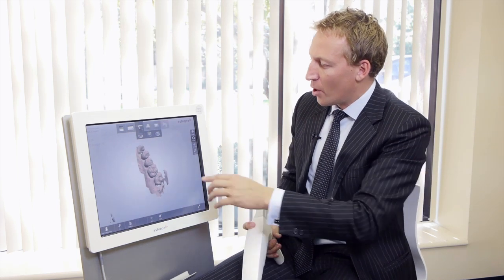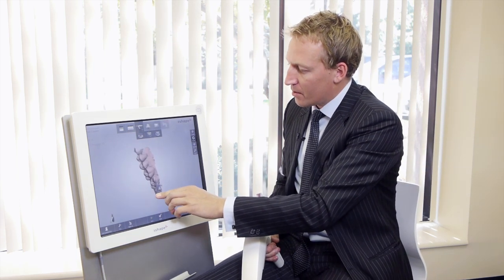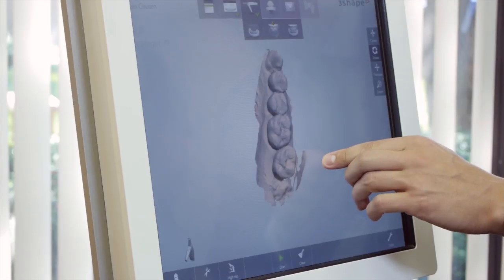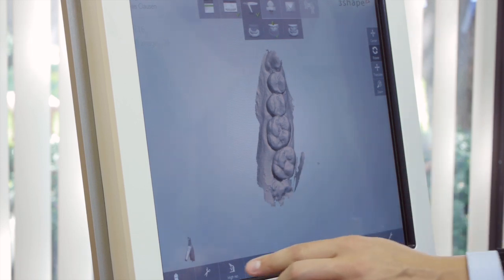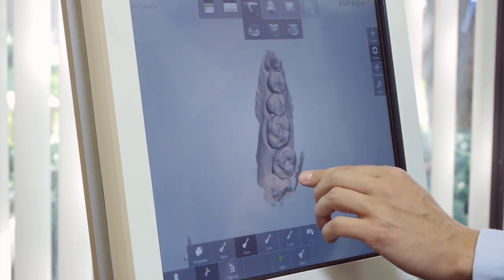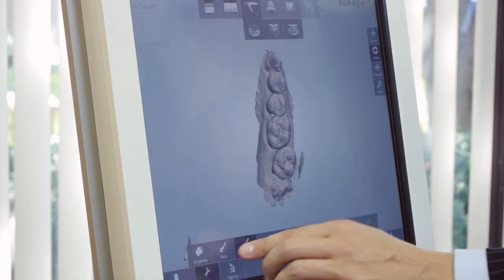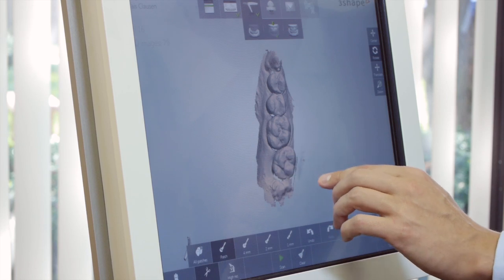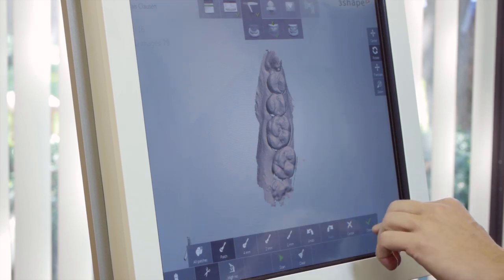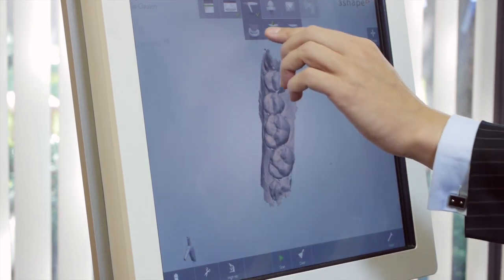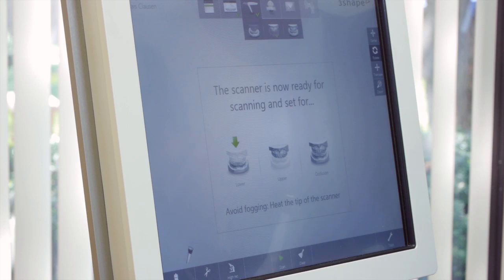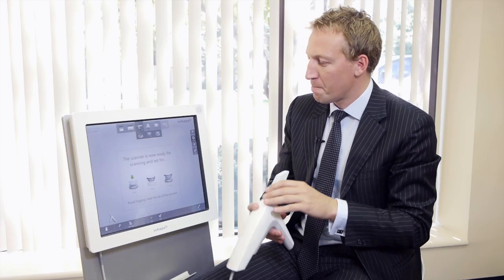So I have here the lower jaw. You can take a quick look. Does it get a little bit of the cheek here. That's not a problem. You can trim that away really easily. So patch like this and like that. So then moving up to the exit that was upper jaw. Now I'm moving to the lower jaw.